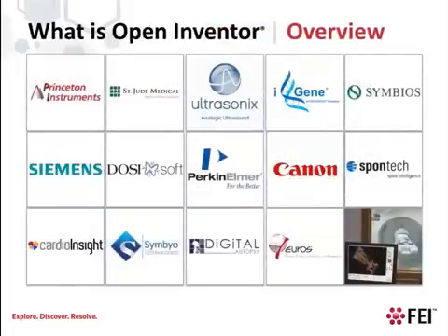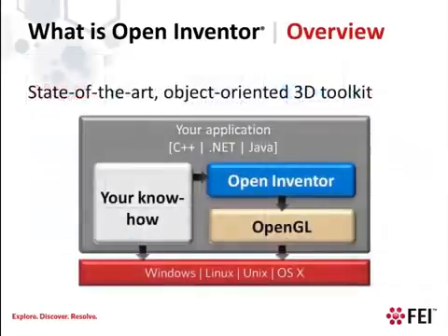Open Inventor is a software development toolkit, or SDK, for 3D visualization applications. As you can see here, an amazing range of medical applications are built with Open Inventor. They include virtual simulation, computer-based training, 3D reconstruction, and interactive visualization software such as digital autopsy software.